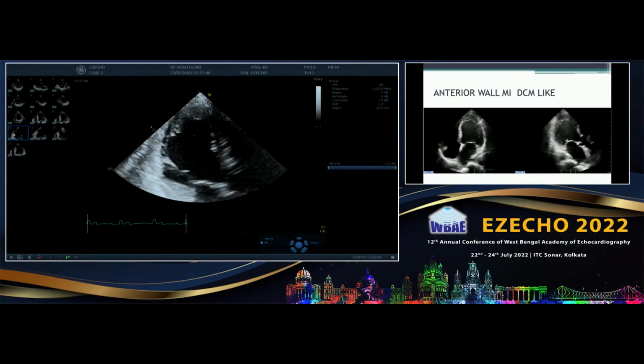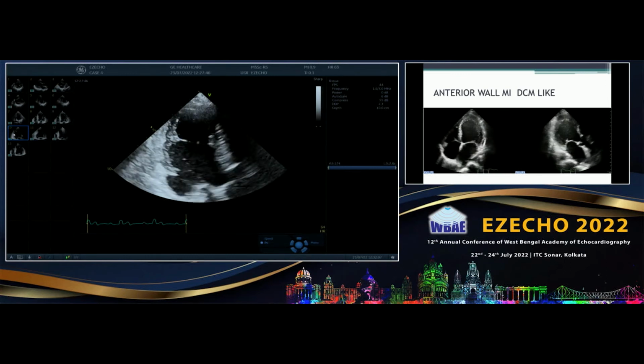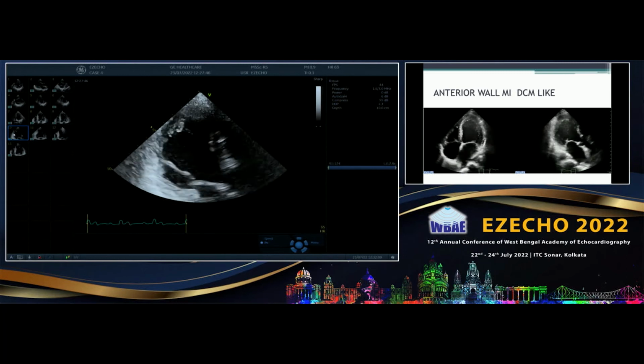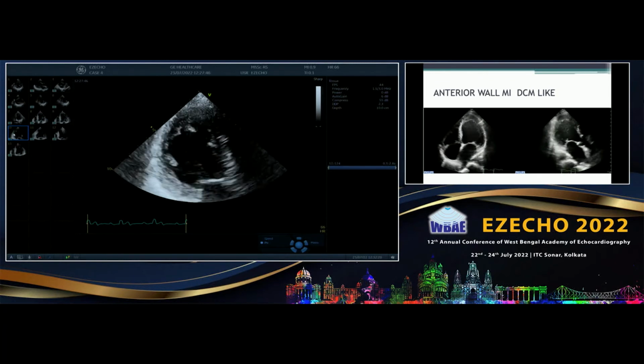Now here it is showing a systolic thickening. Again, one segment at a time. I am not seeing endocardium here, so I am not going to comment. I know it is contracting here, and this is the posterior wall. Posterior wall is also called the inferolateral wall, okay? While our lateral wall is also called the anterolateral wall, okay? But it creates a lot of confusion, so we say lateral and posterior.